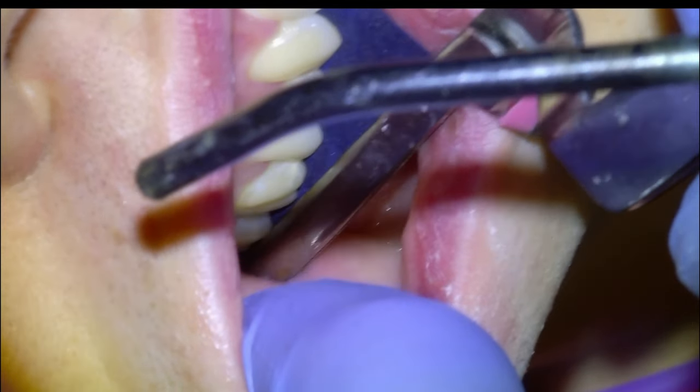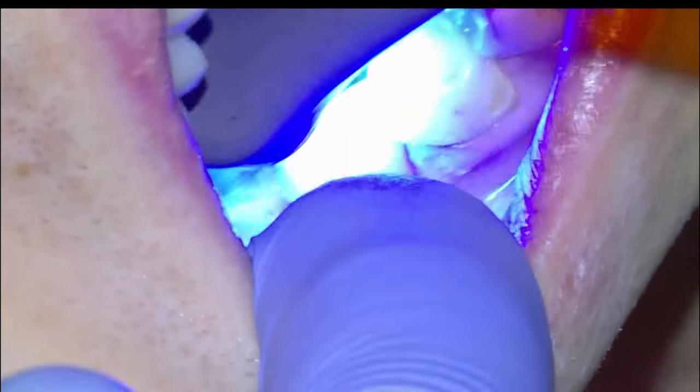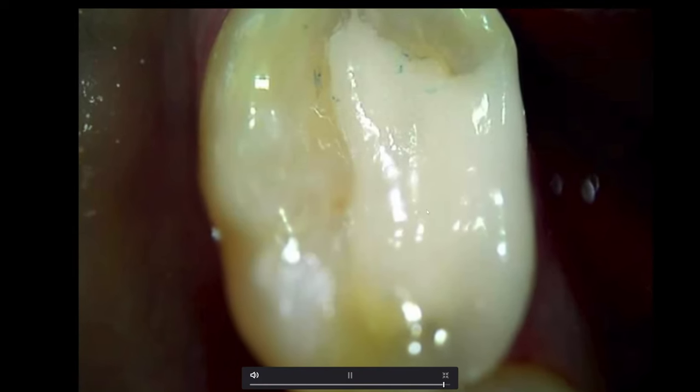And then once we're happy with everything, we will apply the Equia coat varnish and light cure that. And that is going to be it for today. Thank you.